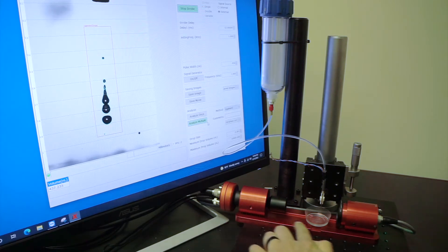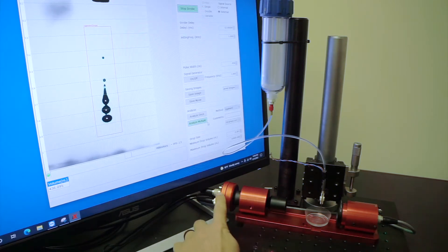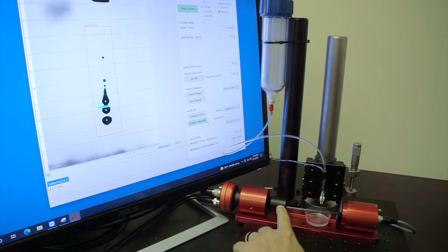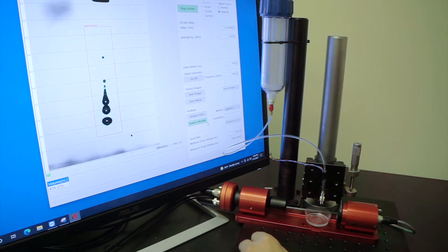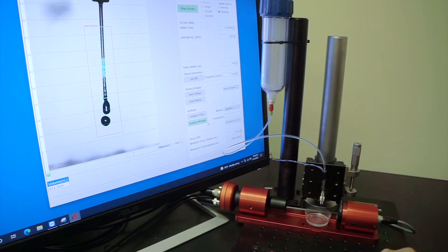As you can see, the entire hardware is a compact footprint, including a camera, a fixed magnification lens, and a high-speed LED strobe light.